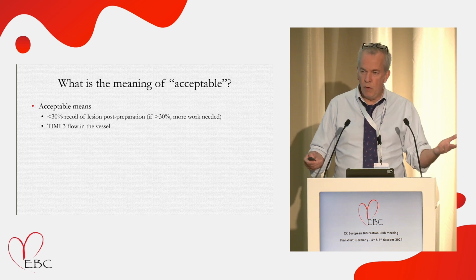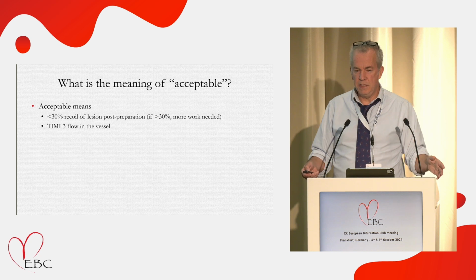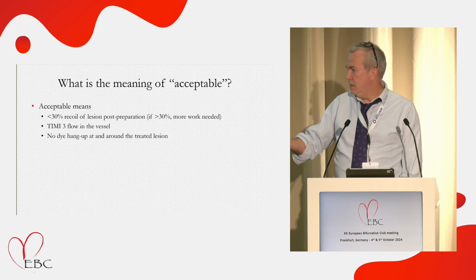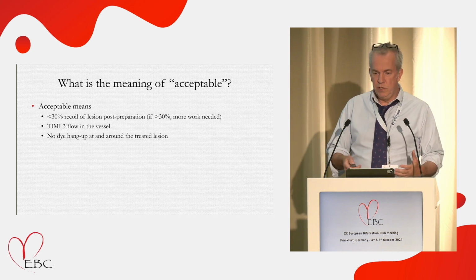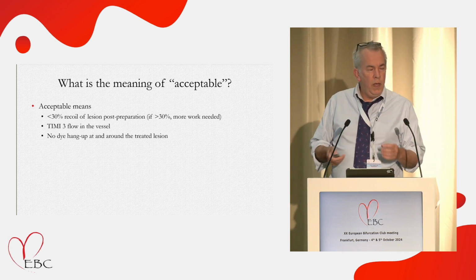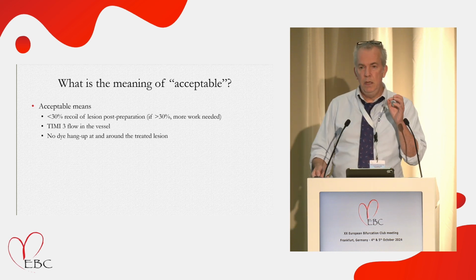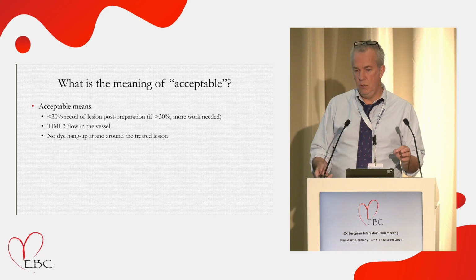TIMI 3 flow, obviously, is very important. You're not going to end up leaving something that has less than TIMI 3 flow. And in terms of the dissection, I think it takes a while for people to learn what is acceptable to leave and what is not. The exact wording is still being negotiated, but no dye hold up at and around the treated lesion.